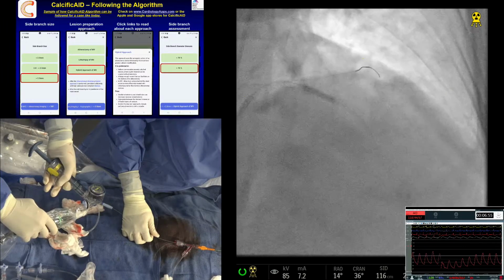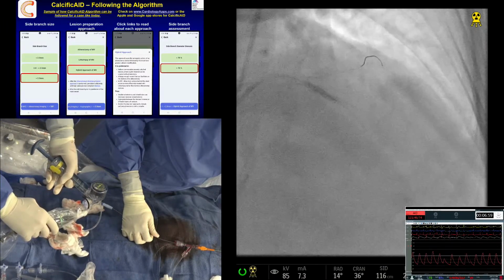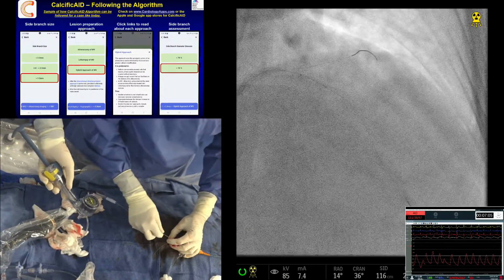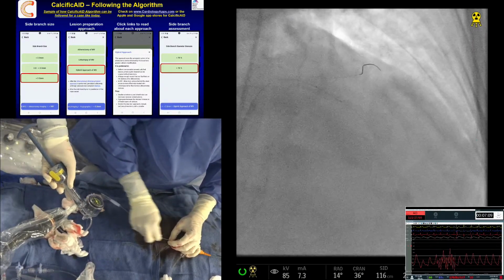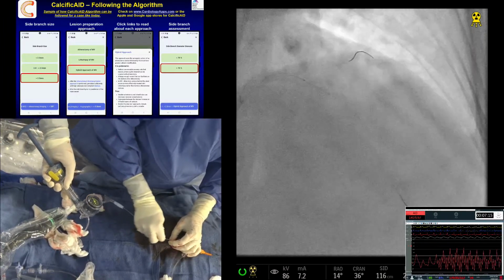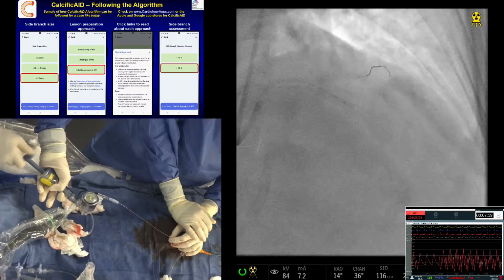What I'm saying is, when IVL did not go, should we have gone to the 1.75 burr? Yeah, I think that is what Samin was indicating also. Okay, so let's see now. It'll go up here slowly, inching through. So go 6 and then 8 there.